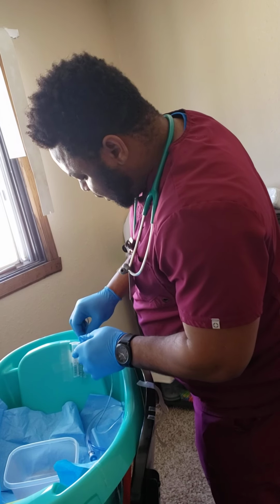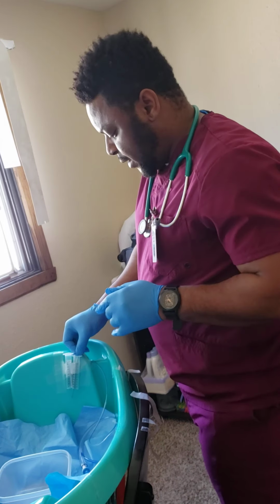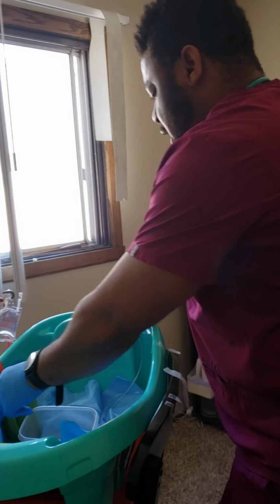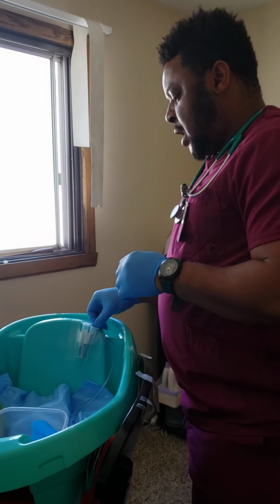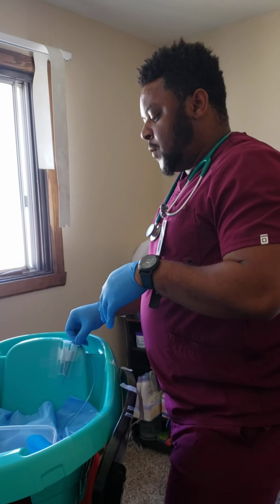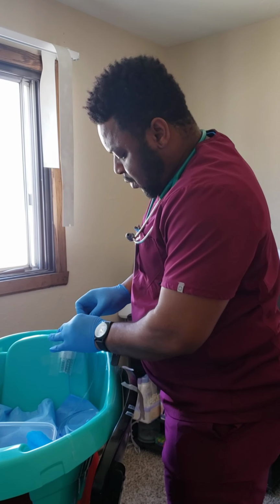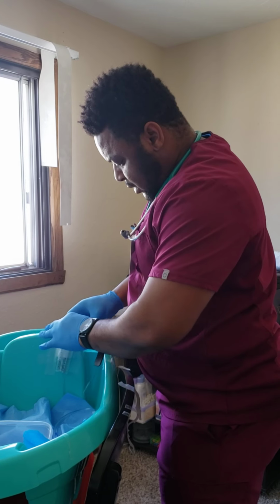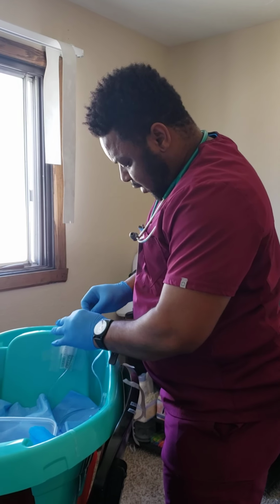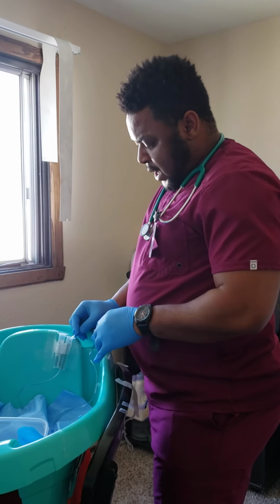And when the tube has just gone past the oropharynx, I will stop and hold my tube right there. Then I give my patient a cup of water with a straw and ask my patient to take a sip of water. As they take a sip of water, I tilt their head forward and continue to insert the tube downward. Take a sip of water, take a sip of water. Okay, when my tube has reached the point where I marked, I will then stop.